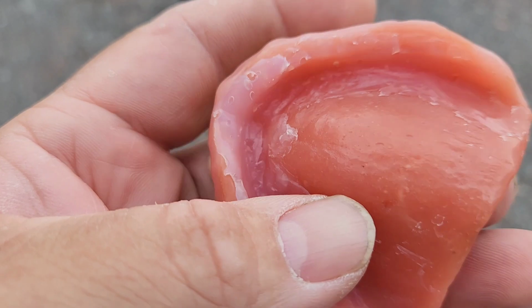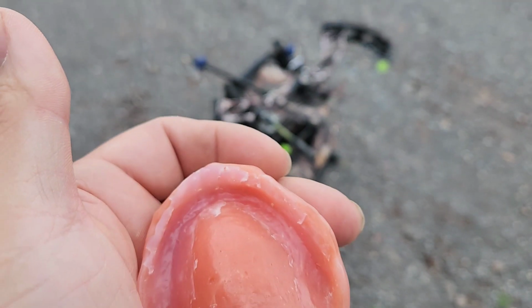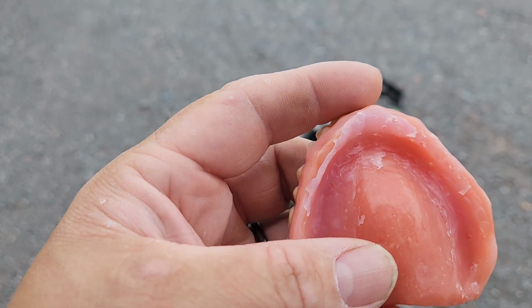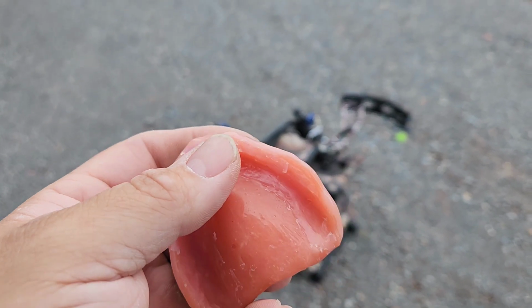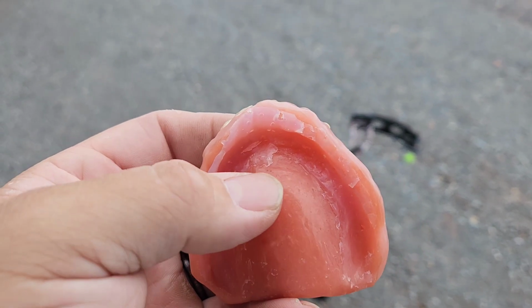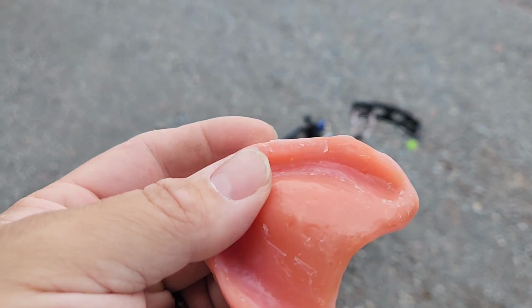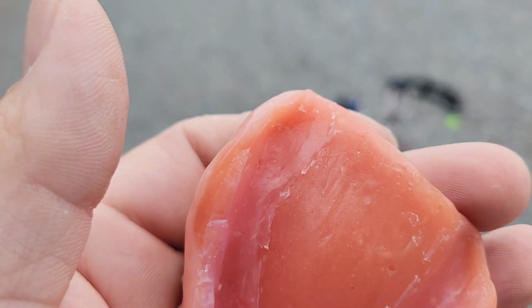So what I did was I started whittling away. I'll zoom in here. I'll show you what I'm talking about. Okay, so what I want to show you is I put too much on there. And see, it's really kind of hard to tell. But I was whittling away at it. I used the stuff that I used to clean it off. I can't think of what it's called, but it comes with the DenSureFit. You use it to clean, it dissolves that. So I took a little bit of that and I wiped around the edges. But I kind of chipped away at the DenSureFit just to kind of make it fit me.